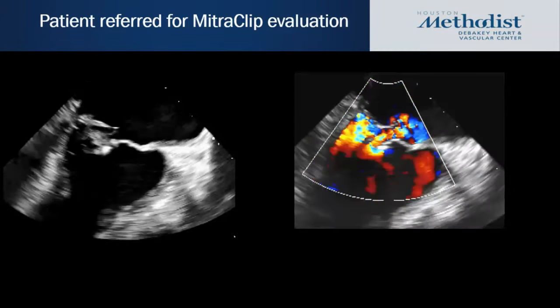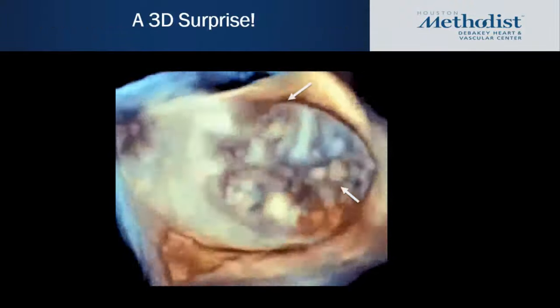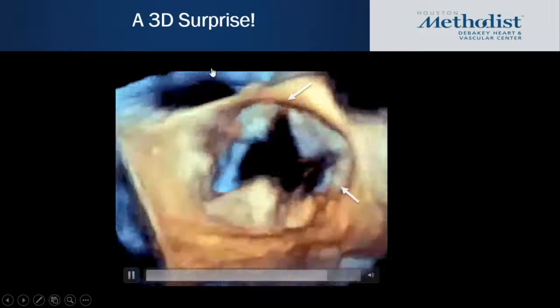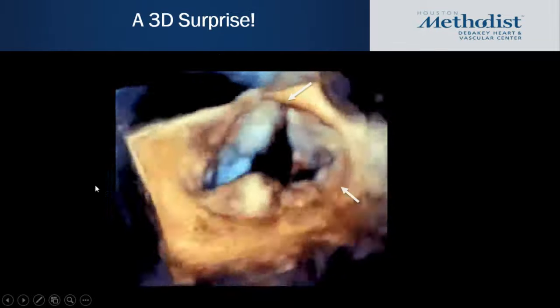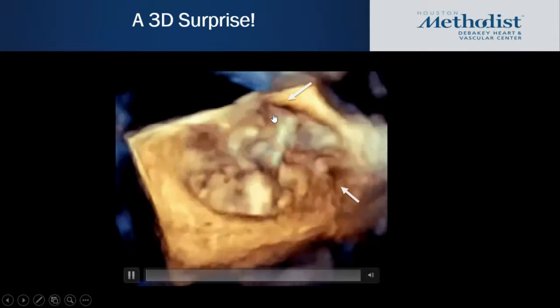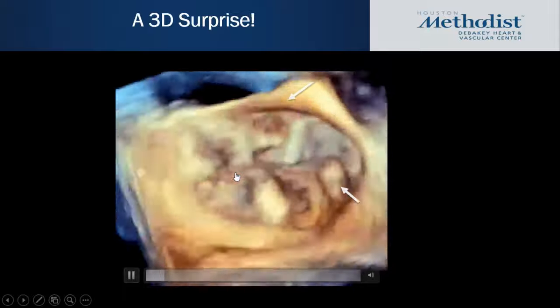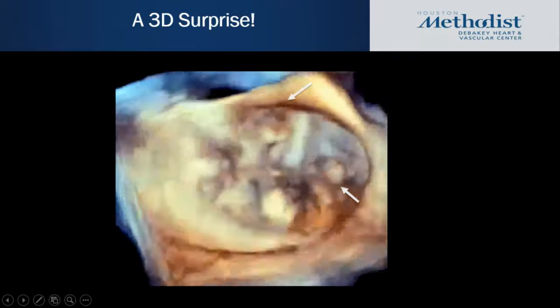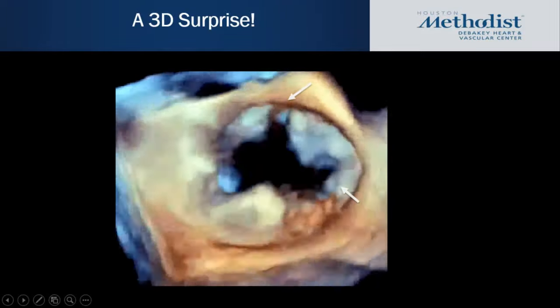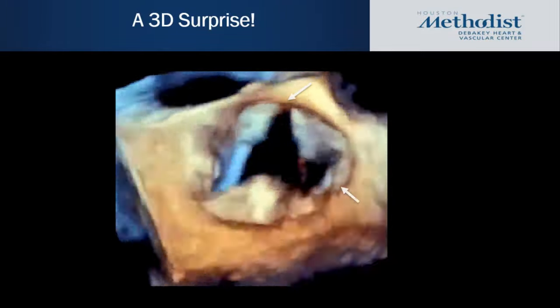So we did our own TEE, and this is what we got. You can definitely see the P3 flail right here. This is the aortic valve anteriorly, the appendage laterally, the septum, and this is the posterior wall. So you see the P3 flail right here, but you also see an anterior cleft, and that has implications in terms of procedural planning. So 3D is very important when evaluating mitral valve pathology.